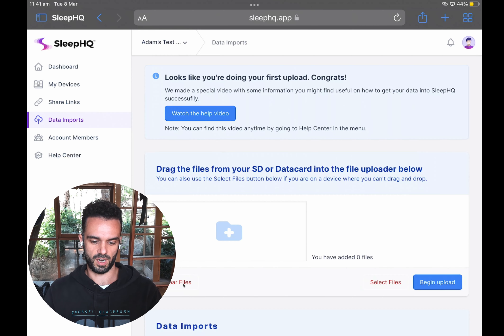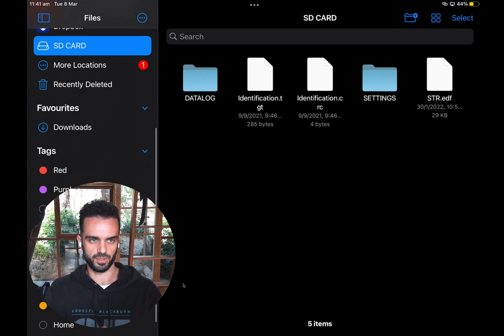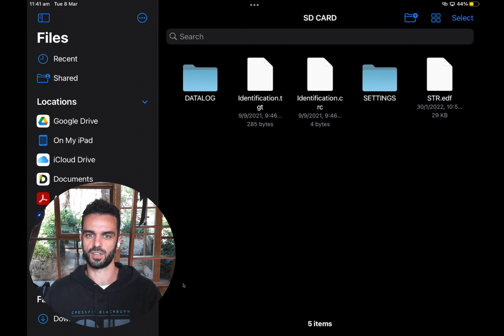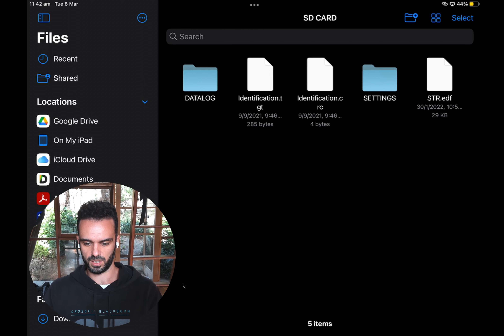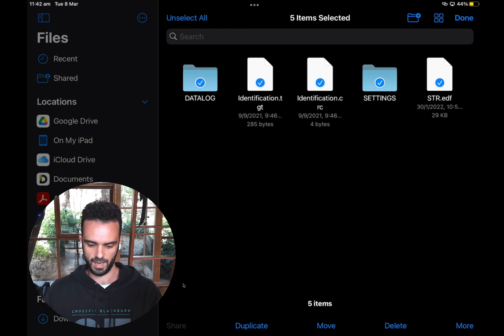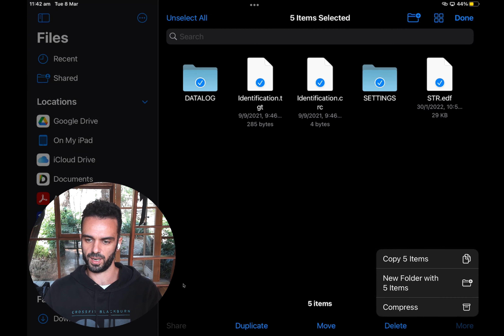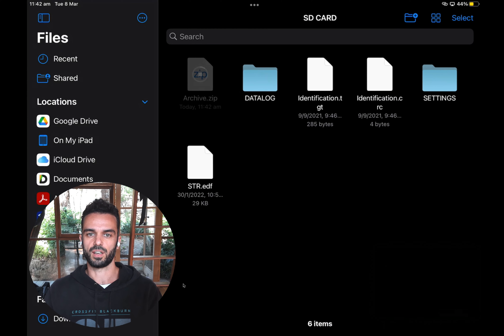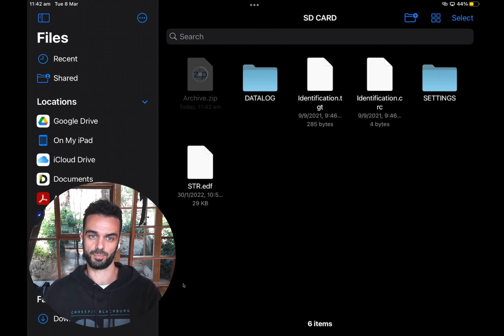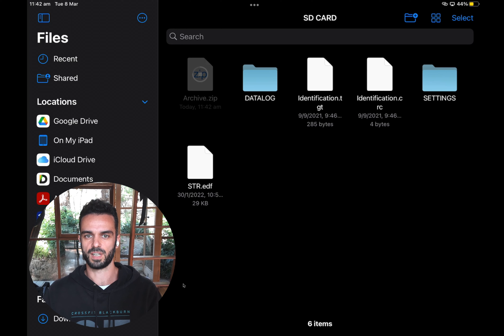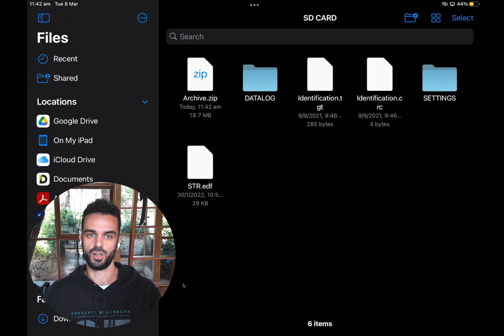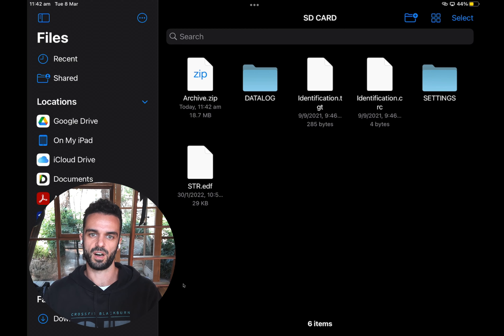For this method, I'm going to open up the Files app. You can see all my files and folders on the left, and I've clicked SD card so I'm looking at everything on it. I'll go to the top right corner, click "Select," then "Select All." Then at the bottom right corner, I'll click "More" and choose the "Compress" option. This creates a new file called archive.zip — it's all the other files and folders compressed into a single file that I'm going to upload to Sleep HQ. This is useful because on iPhones and iPads you can only select one file at a time for uploading, so creating a single zip avoids having to select every file individually.